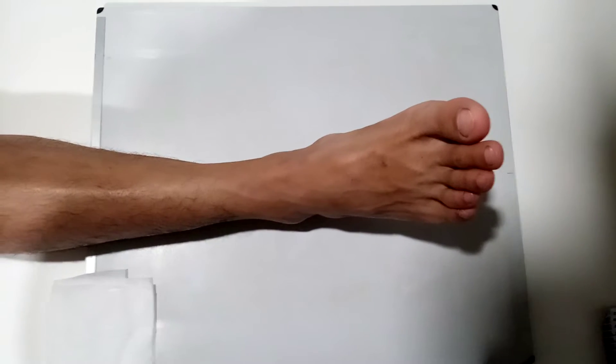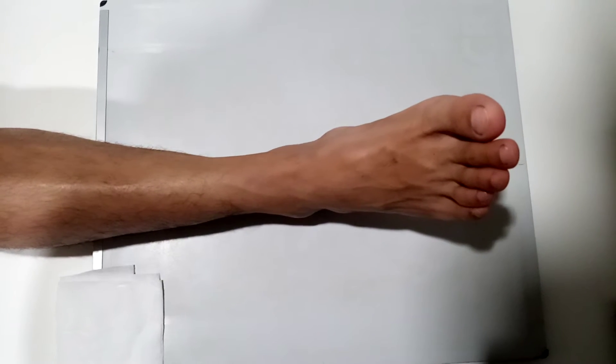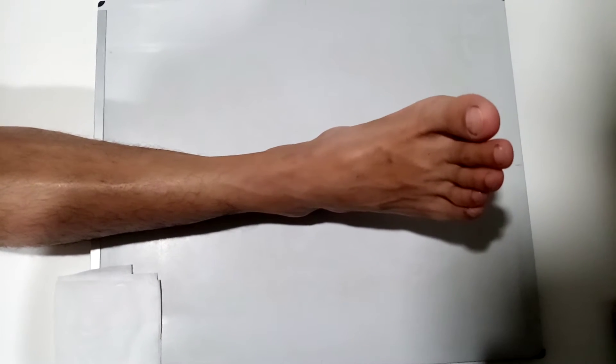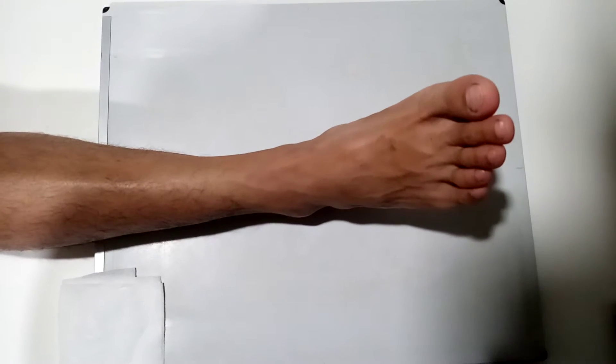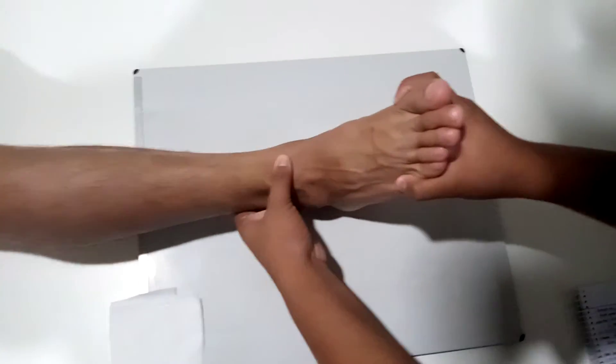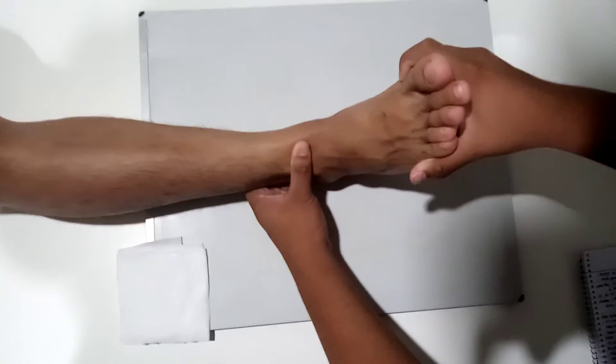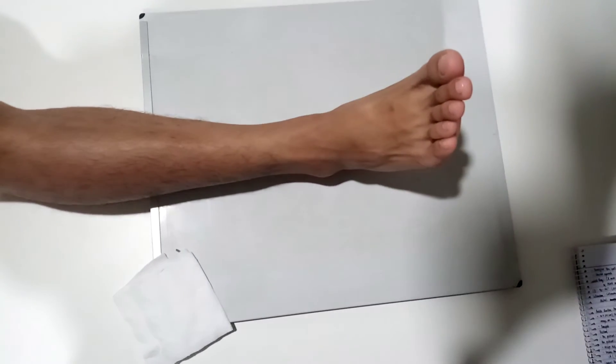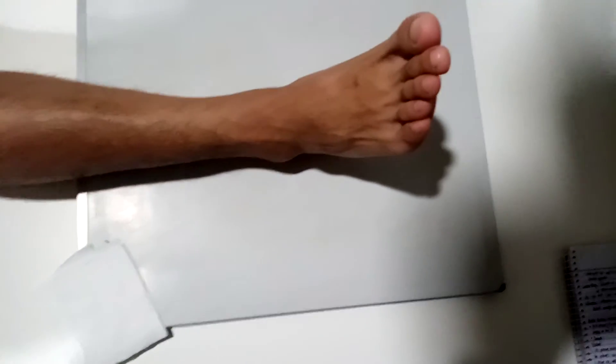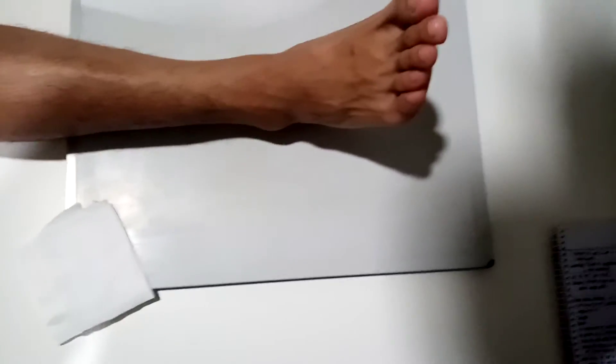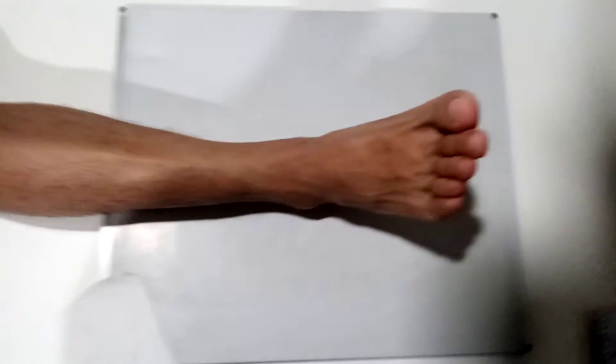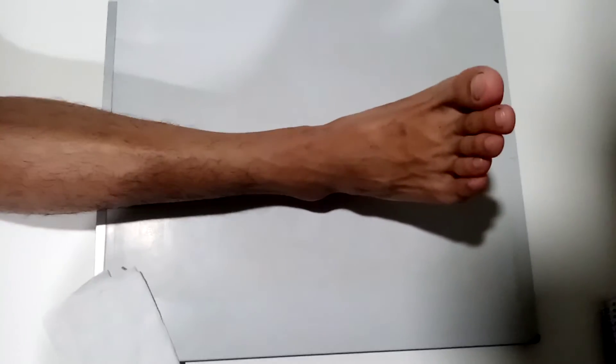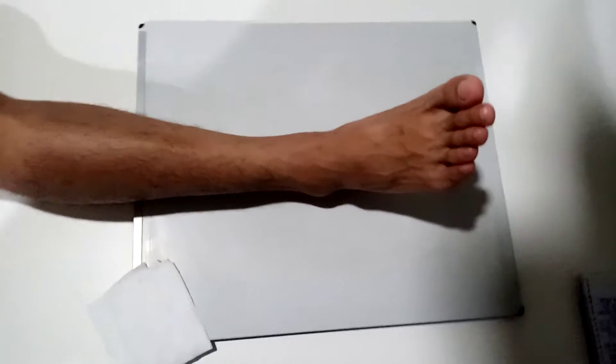The patient must be seated or in a supine position on the table wherein the patient's leg is extended with foot support under the knee. Align the leg and ankle parallel to the edge of the IR arm and centered on the IR arm. Ensure that there is no rotation, long axis of the foot is vertical and parallel to the IR arm. Note that the lateral malleolus will be about 15 degrees more posterior than medial malleolus.